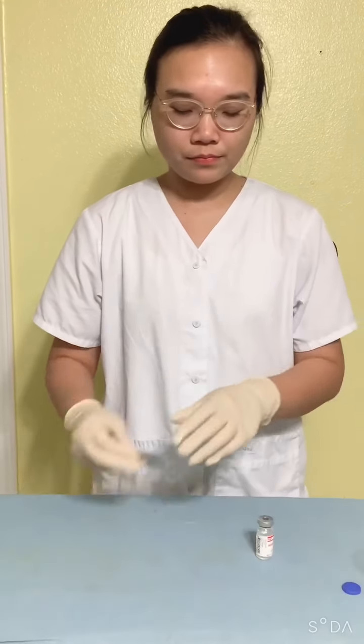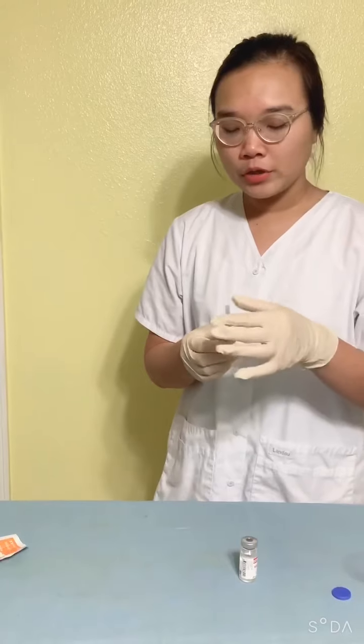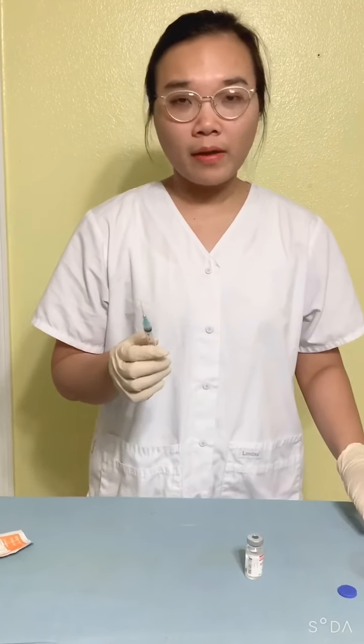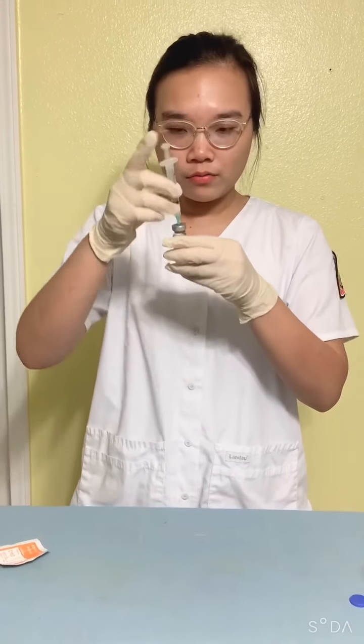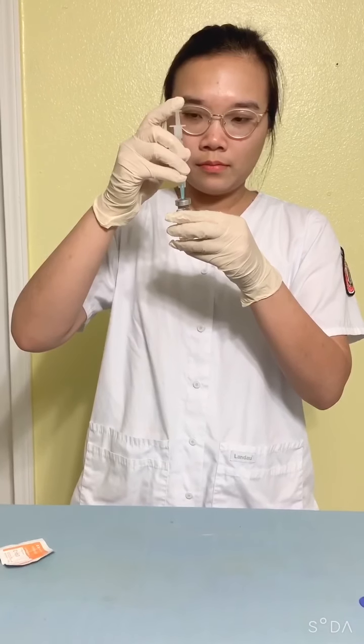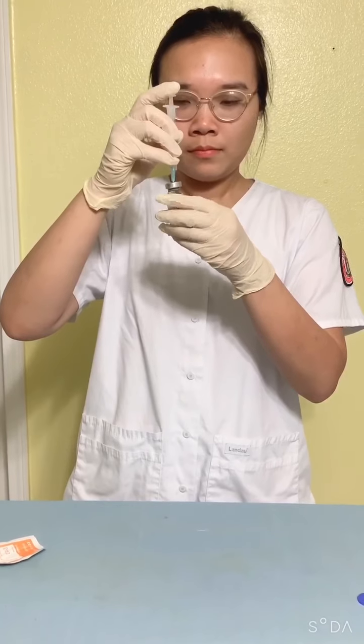Now I'm going to clean the top of the vial. Now I'm going to aspirate the volume of air equivalent to the dose of the medication and inject it into the vial. Now I'm going to withdraw the medication.